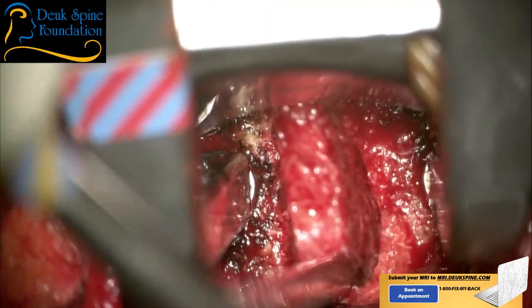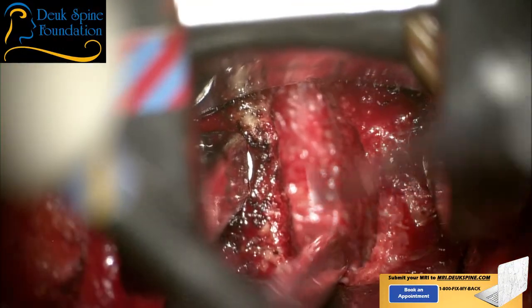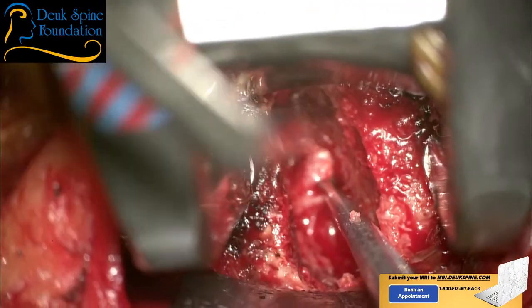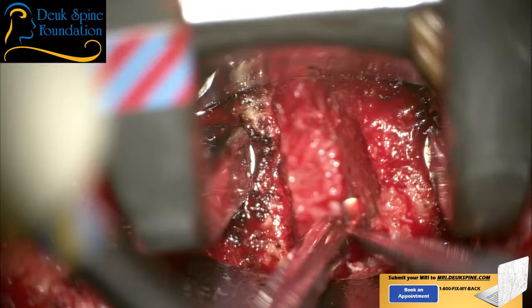Let's have a little gel foam. Actually, let me have the curette first. Curette 2. Let's see if we can get a plane. Stay there. Let's see if I can get a plane here. Suck behind me. Again, give it to me again. Beautiful. Look at that. See the spinal cord, folks?